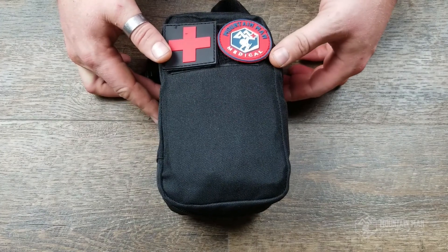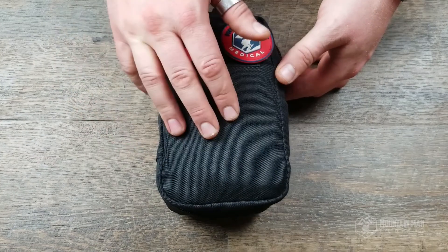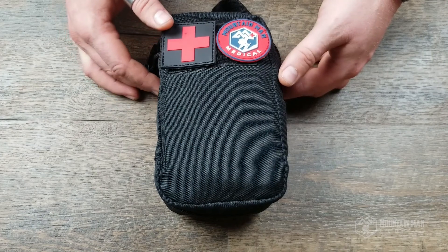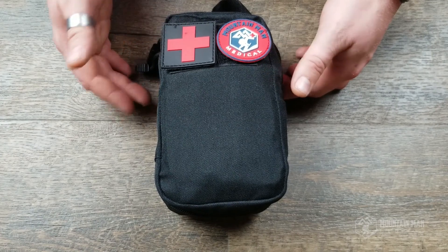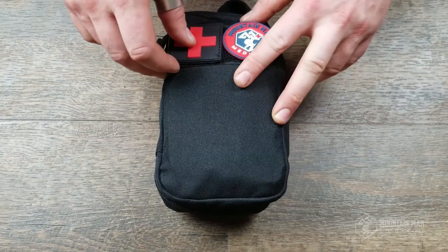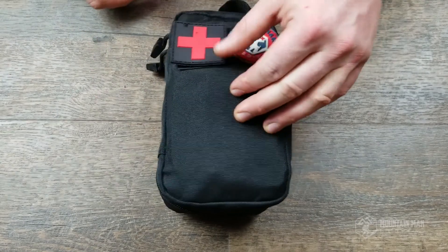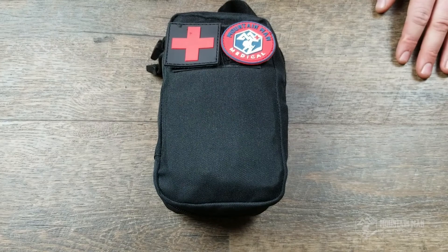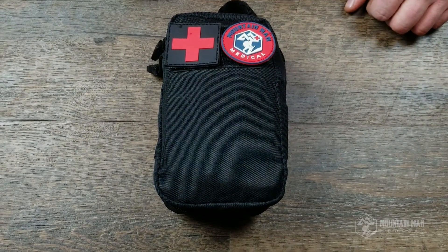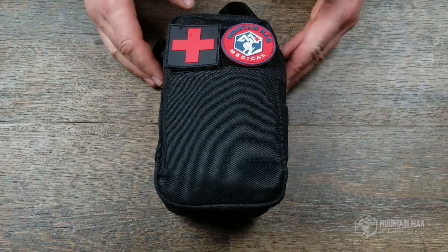This is the Yellowstone trauma kit. We have two kits right now called the Sweetwater and the Yellowstone. The Yellowstone has a few more items in it over the Sweetwater — you can treat a few more wounds with it — but both kits come in a bag this size. On the outside we've got the hook and loop for your patches, so you can have your medical patch for high visibility so everybody knows this is a medical bag.